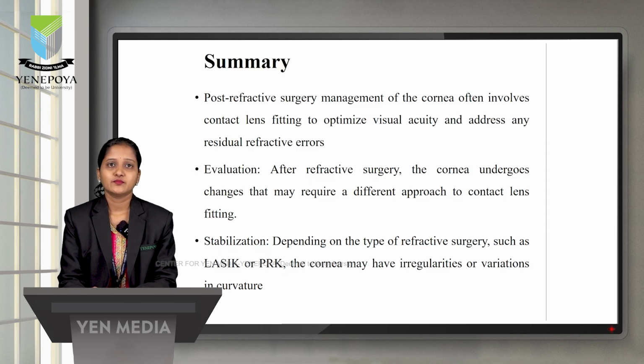To summarize, post-refractive surgery management of the cornea often involves contact lens fitting to optimize visual acuity and address any residual refractive errors. After refractive surgery, the cornea undergoes changes that might require a different approach to contact lens fitting. Depending on stabilization and the type of refractive surgery, such as LASIK or PRK, the cornea may have irregularities or variations in curvature which might need to be corrected with a contact lens as a better option.